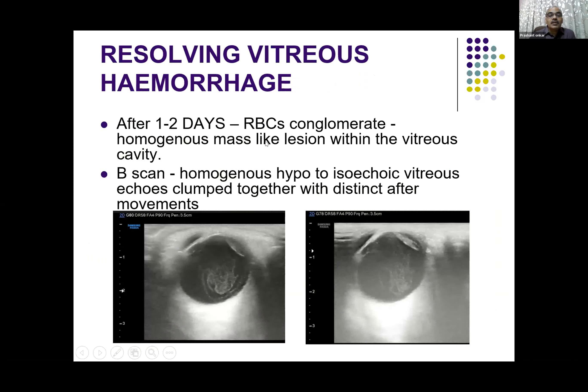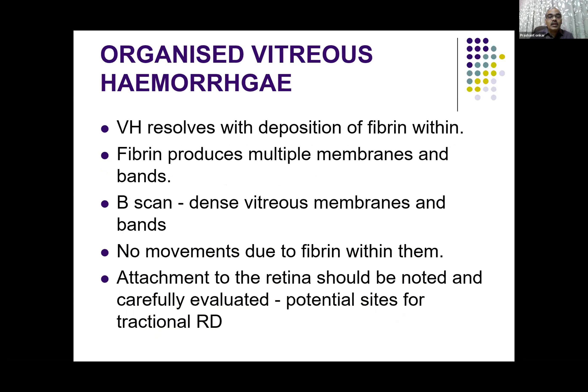As it resolves after a couple of days, they conglomerate and become a mass-like thing in the vitreous cavity — it can be hypo or isoechoic. They get clumped together and still have good after-movements. As it gets organized, there is deposition of fibrin and it develops into membranes and bands, which we see on high resolution ultrasound.